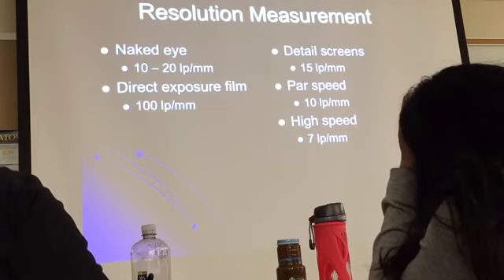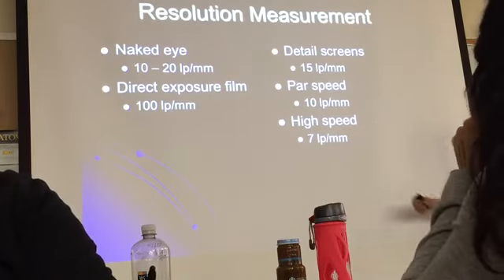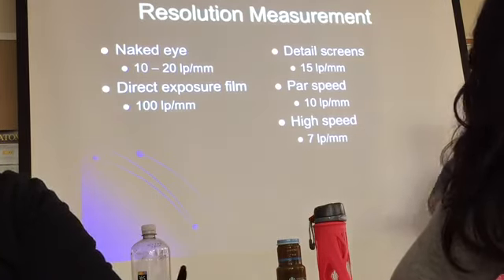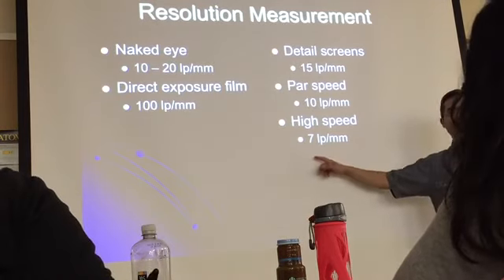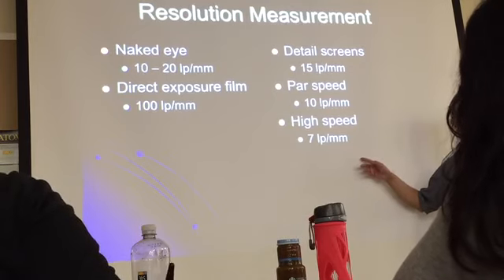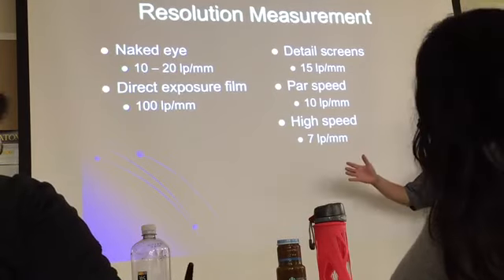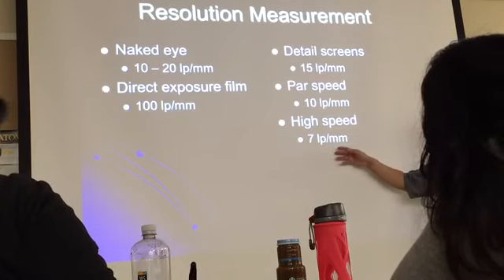Okay? So far so good? Digital systems. All of you that are into the newer stuff, and yeah, we get newer is better, can only show you maybe 2 and 3 lines per millimeter. Your very expensive $150,000 detectors can only show you about 3 lines per millimeter.